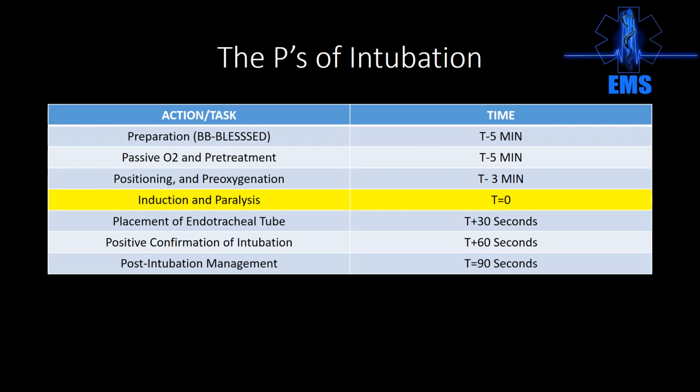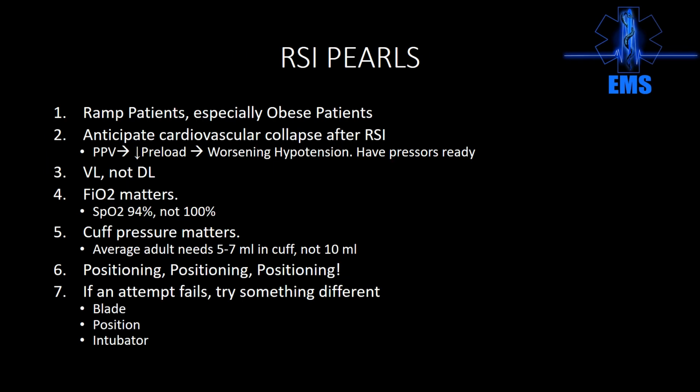If we got a shark fin, we got a problem with what? Not oxygenation, but ventilation, and the patient is air trapping. That means we need to slow the rate down and provide deeper breaths. And then lastly, post-intubation management. And this is why we pull up the post-intubation drugs, because as soon as the patient gets intubated, we give them a big slug of something so they don't remember it. But more importantly, they comply with the therapy. They don't reach up and pull the tube out. If that hasn't happened to you yet, it's coming.